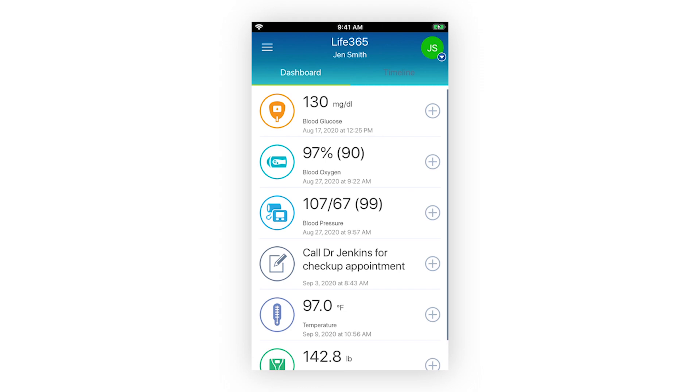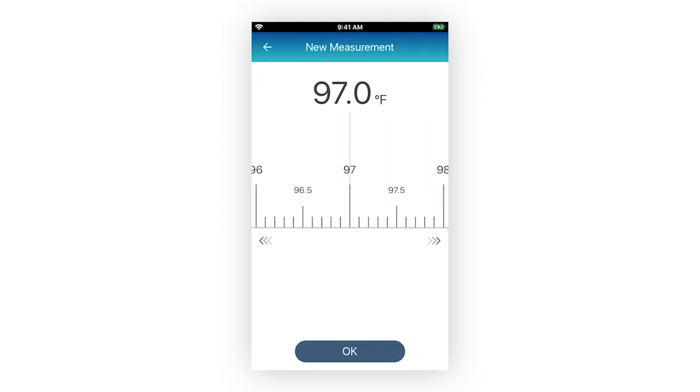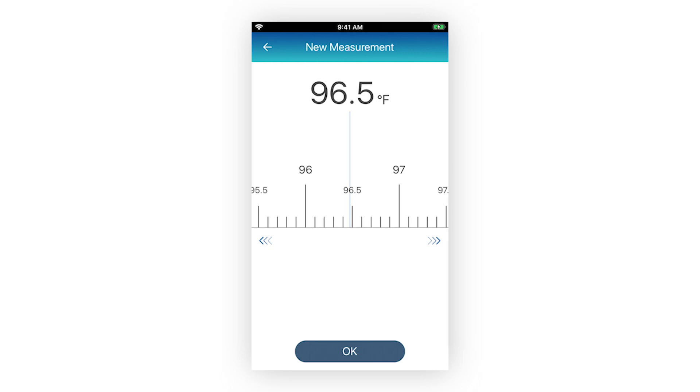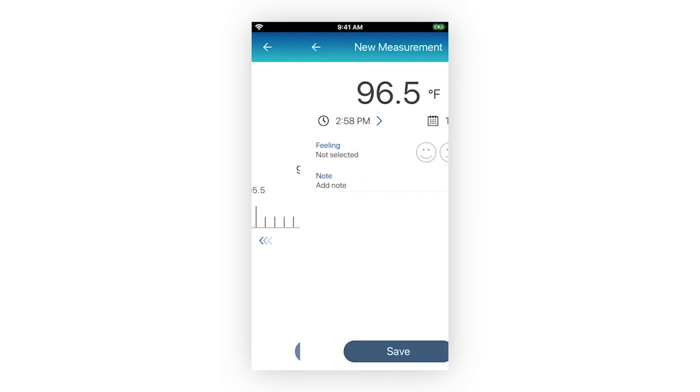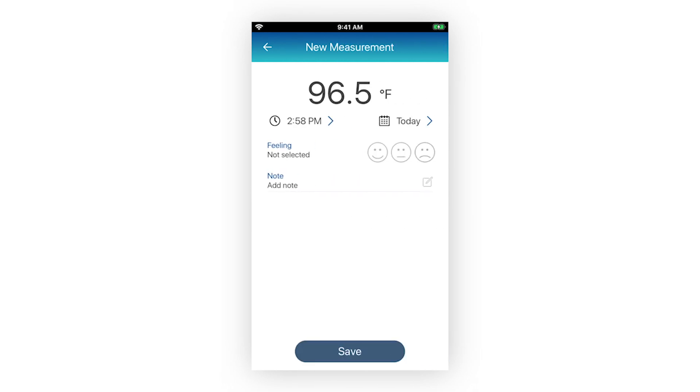To manually enter measurement readings, navigate to your dashboard screen. For the measurement type you wish to enter a manual measurement reading for, select the plus icon located on the right side of the measurement type. Enter the measurement reading that is displayed on your medical device. Once entered, select the button OK.